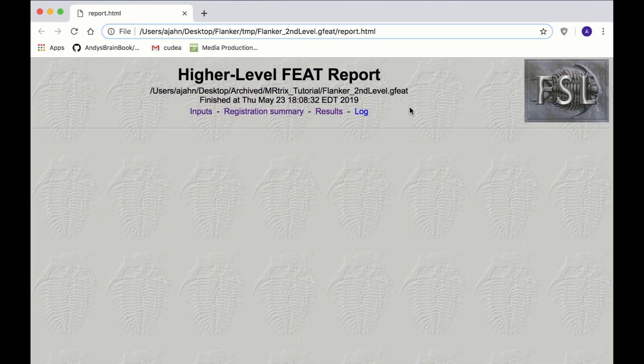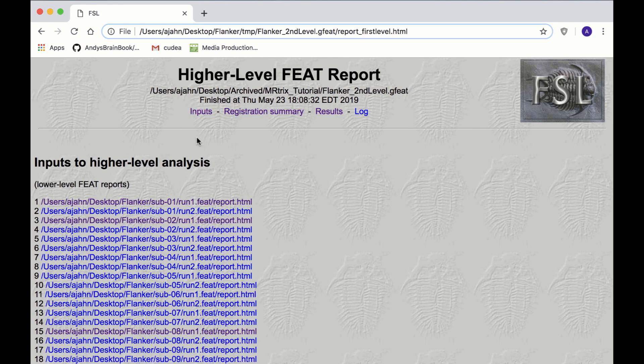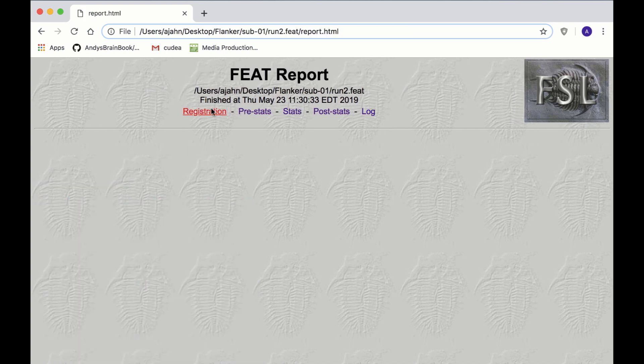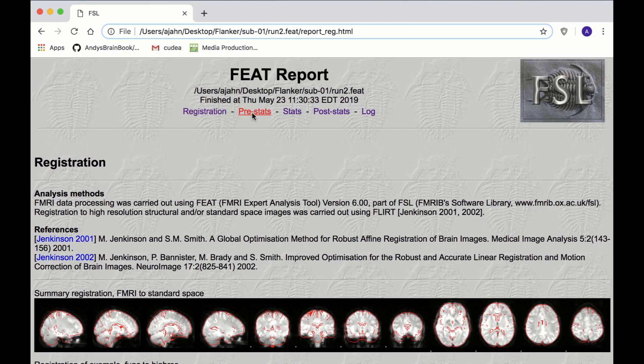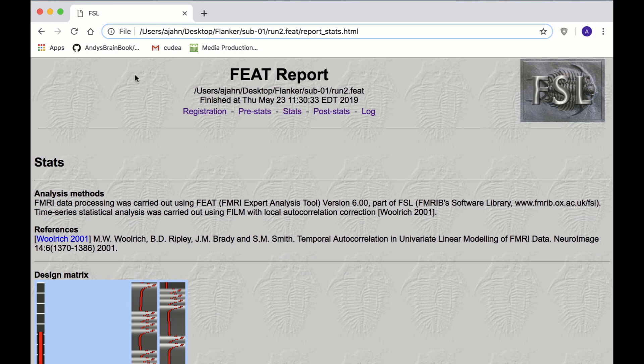When it finishes, you will see an HTML web page like this, similar to what you saw during preprocessing. The Inputs tab shows the preprocessing and first level results for each feat directory for each subject, which you've seen before.